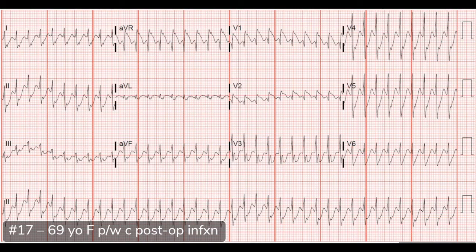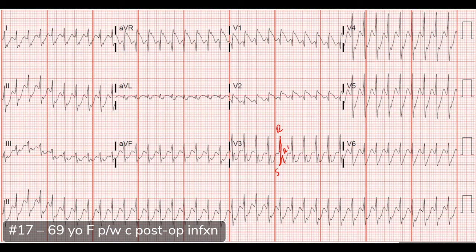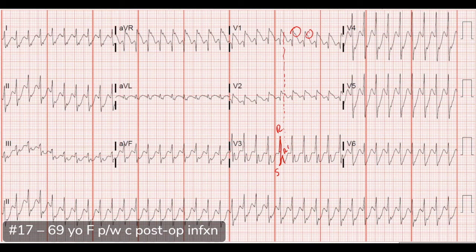Looking at the original ECG again, there is a right bundle pattern in this fast wide complex tachycardia that could be consistent with her underlying RBBB — this very well might be SVT with aberrancy. But there are features against that. Looking at V3, we can identify the R, S, and R prime — RSR prime. If the first R is greater in amplitude than the R prime, that's almost always ventricular in origin.